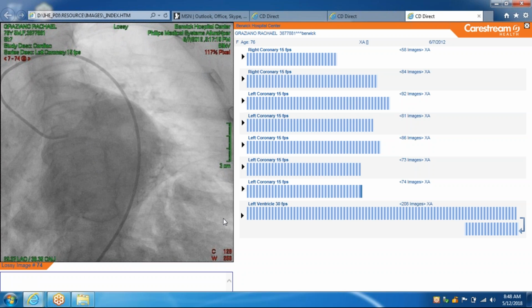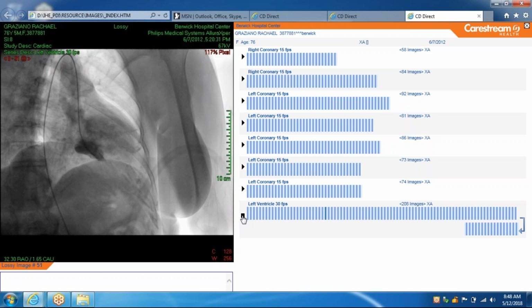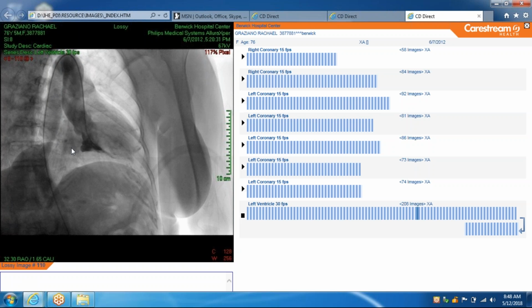And then per my protocol, I move on next to the left ventriculography. Pigtail catheter in the LV, and you just inject dye and look at how well the heart pumps the blood out. So you can see that this patient has mitral regurgitation. Look here. When the LV pumps the dye, you can see dye going back over here. That's because of mitral regurgitation.